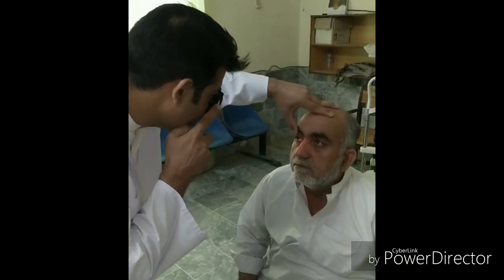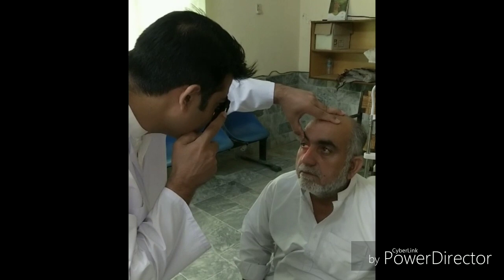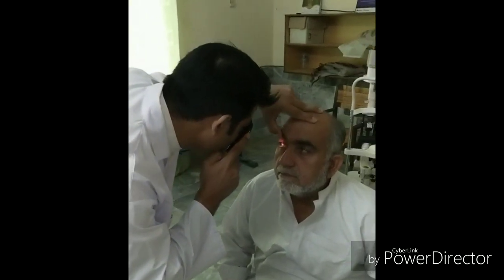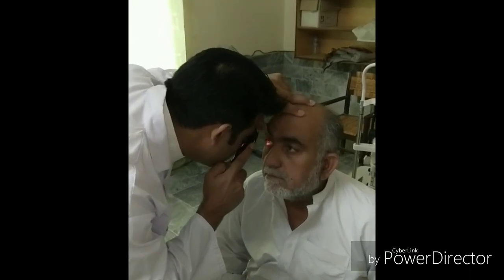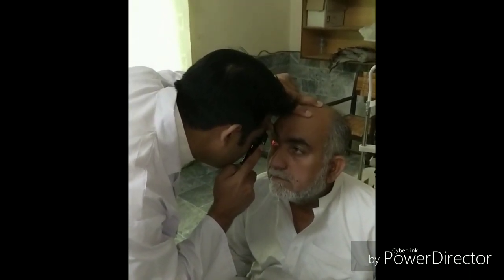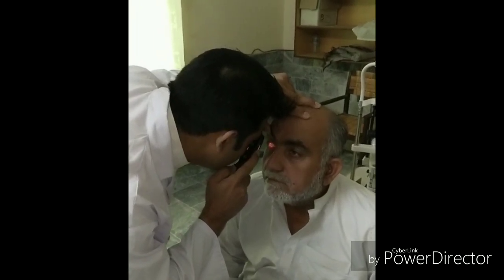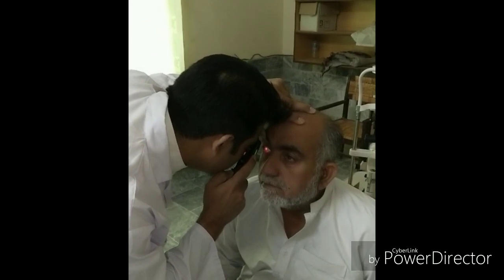The first step is distant direct ophthalmoscopy to check the red reflex, done roughly at arm's length. This will highlight media opacities in the cornea, lens, vitreous, and retina. Then slowly come closer while dialing in the plus 10 diopter lens to see the anterior chamber, and then move even closer.